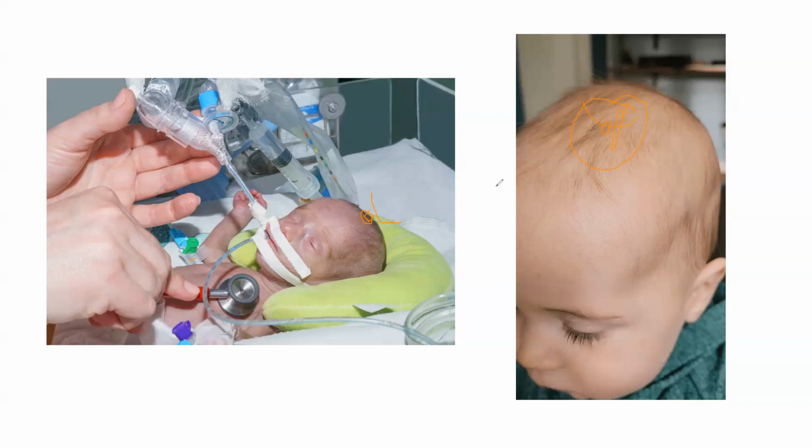Again, I'm just giving you a flavor, and I don't want you to worry. Some of you will not have a curvilinear probe on all your machines. But really, the question from our perspective is what we can then use next, and it's about working with your probes to optimize your images based on our understanding of physics today. Any questions about this? The standard probe is usually a curvilinear probe.